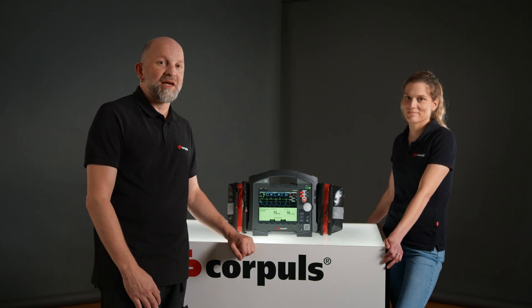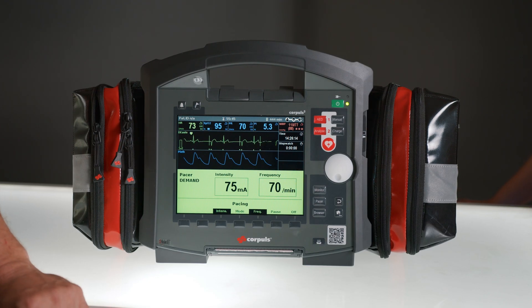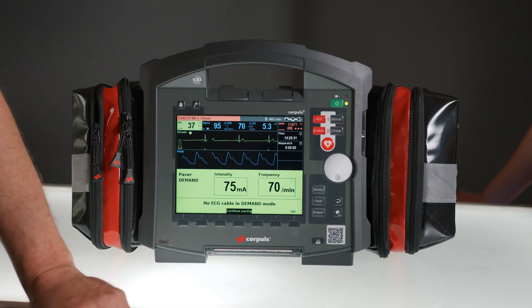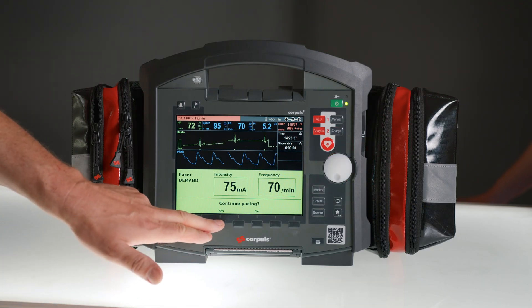Should it happen that an ECG electrode becomes detached that is responsible for ECG lead 2, the stimulation will be interrupted first. A technical alarm will occur and we will be asked whether we want to switch to the fixed mode. If we solve the issue and reposition the ECG electrode within 10 seconds, the therapy will automatically continue in demand mode. Outside this time window, we must first confirm and then actively resume the stimulation.